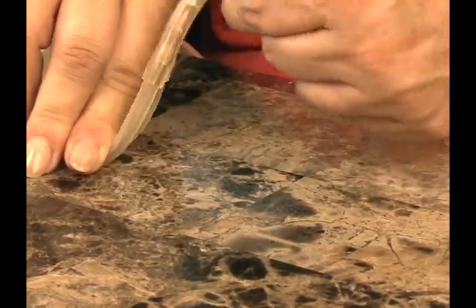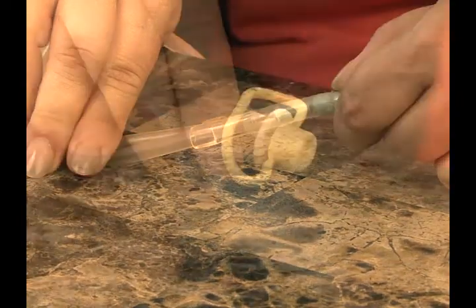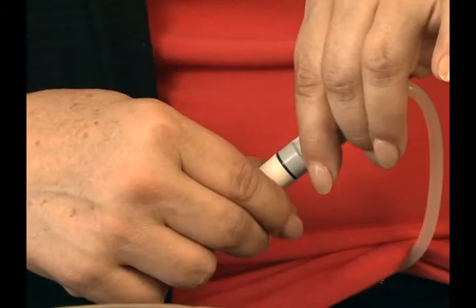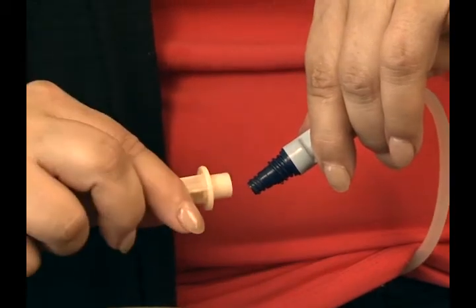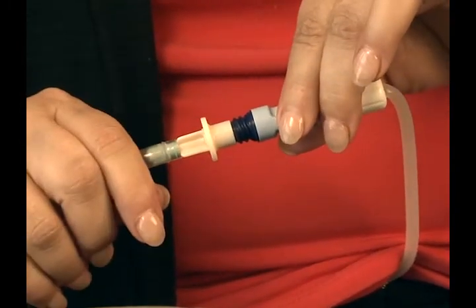Again, you must bend the frangible back and forth to make sure it is completely separated. When the blue frangible is broken, remove the pull ring from the UltraBag system patient connector. Do not touch the sterile end where the pull ring was attached. Once the pull ring has been removed, do not reuse the solution container. Remove the MiniCap disconnect cap from the transfer set and immediately connect the transfer set to the UltraBag system. Do not touch the end of your transfer set. Hold the transfer set steady and twist the UltraBag system patient connector until it is firmly secured.